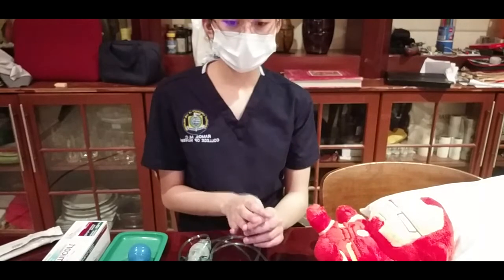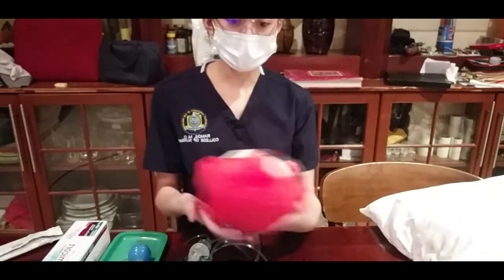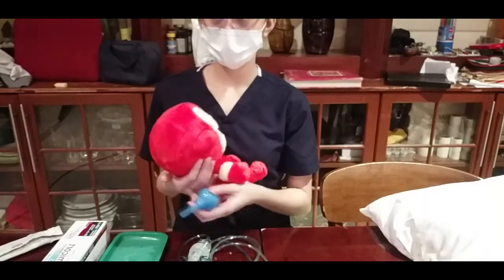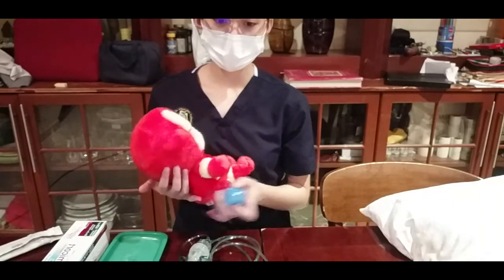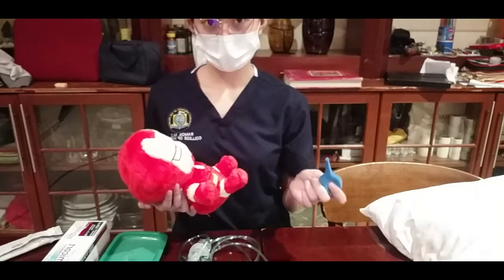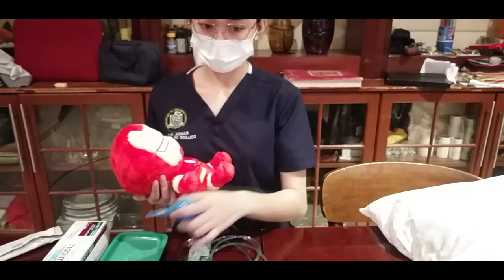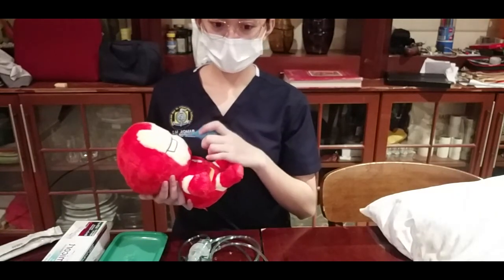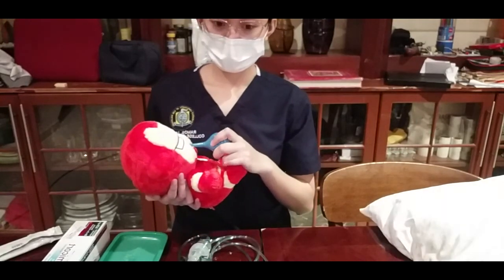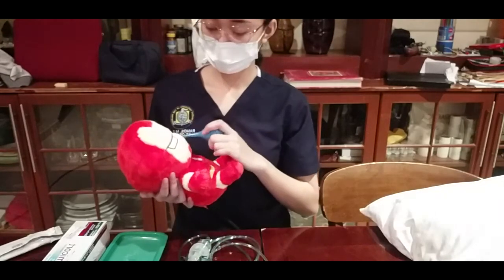Next, I will also be observing for a patent airway, and I will be removing secretions by having the patient cough. So it's either by coughing or by expectorating mucus or also by suctioning. And secretions plug the airway, decreasing the amount of oxygen that is available for gas exchange in the lungs.